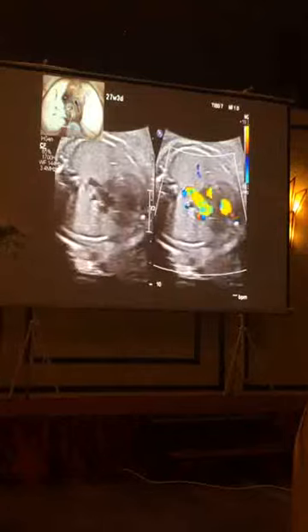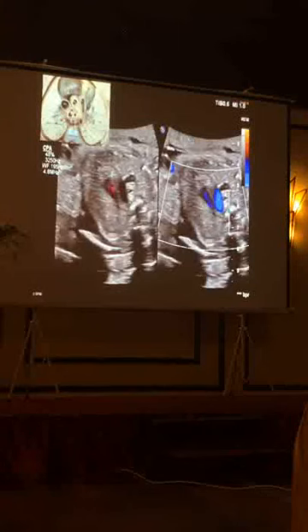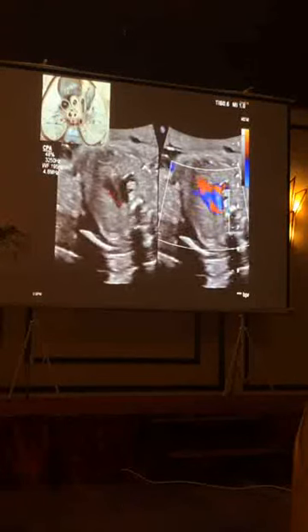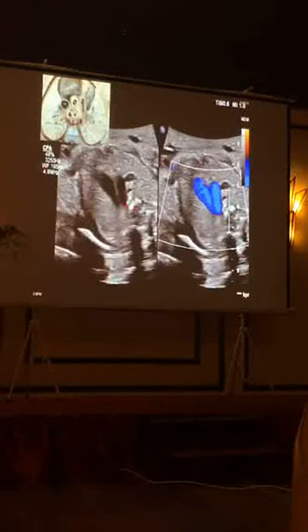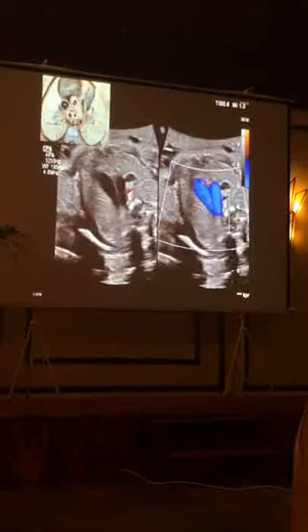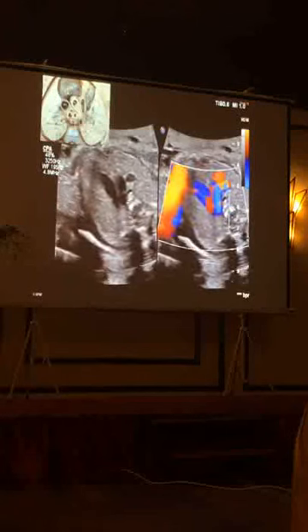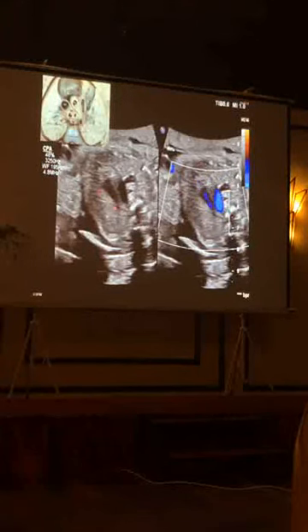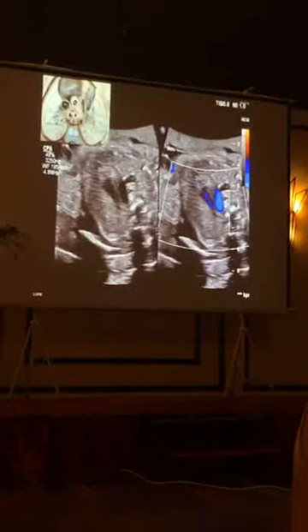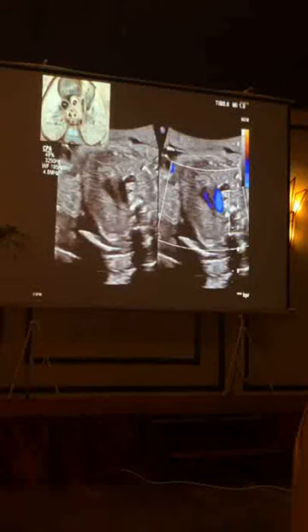And in order to get a proper image, you just have to move downward, and then you can see this very typical V. And you have to make sure that both the ductus arteriosus and the aortic arch are to the left of the mid-sagittal plane. That, of course, is also very nicely shown by the position of the trachea, which is here. So this is our three-vessel trachea view, as it should be. So the ductus arteriosus, aortic arch, superior vena cava, and the trachea, and the great vessels are to the left of the trachea. The superior vena cava is to the right.